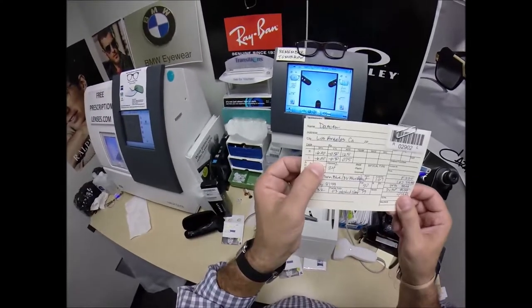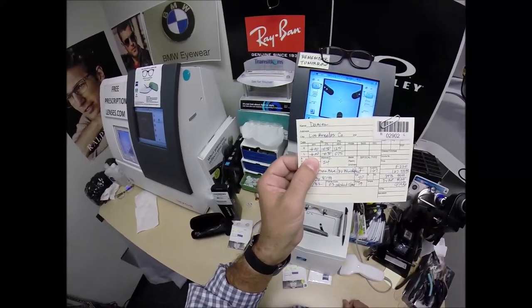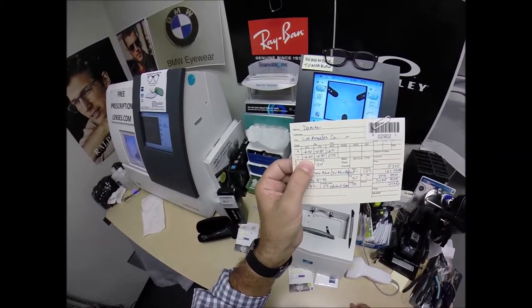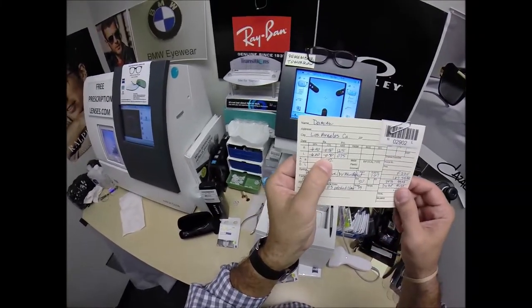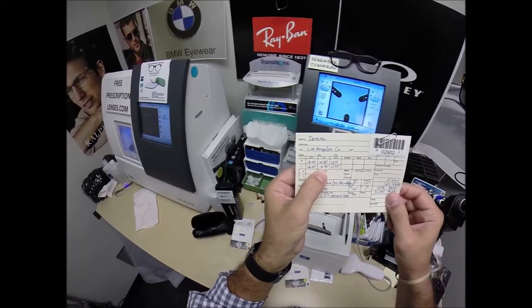Now, the average prescription goes to about a minus 2 to 3, so you're at twice that. Now, you have less than average astigmatism. It's usually around 1 is the average.